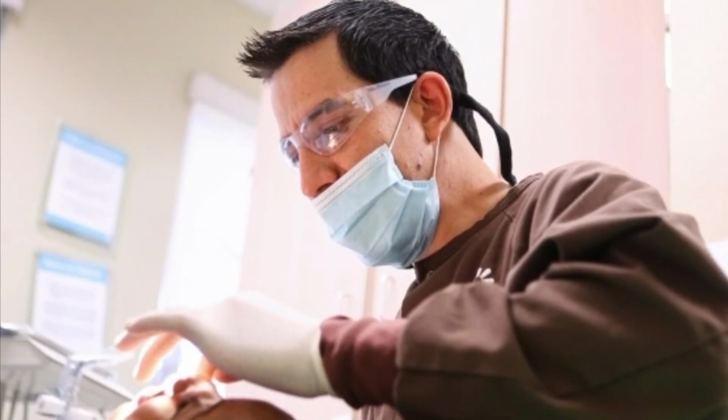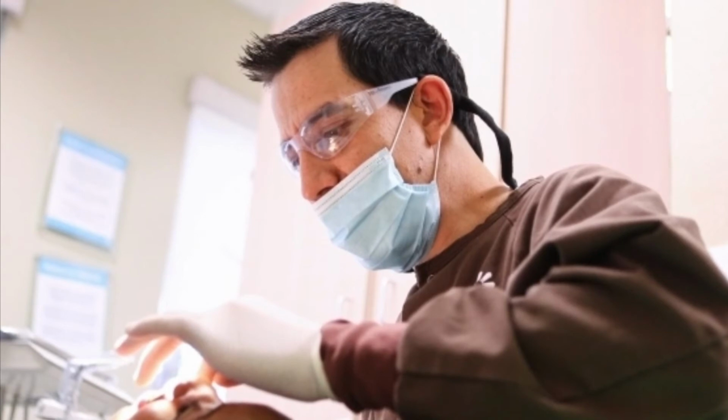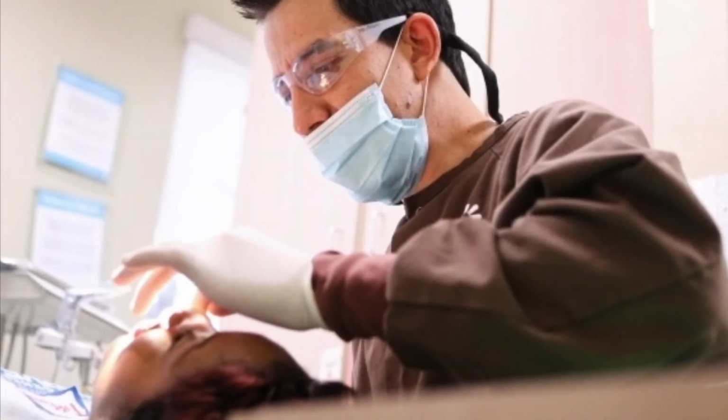If the radiograph results are too long, for example 3 mm long, here we have to subtract 4 mm and take another radiograph.